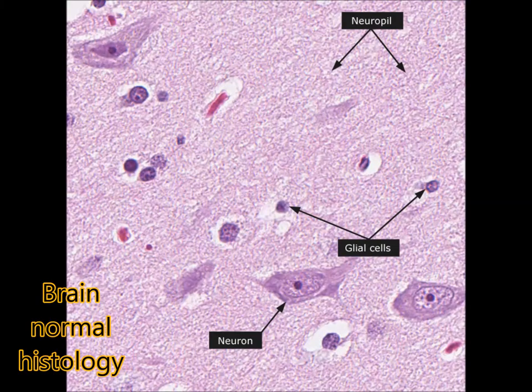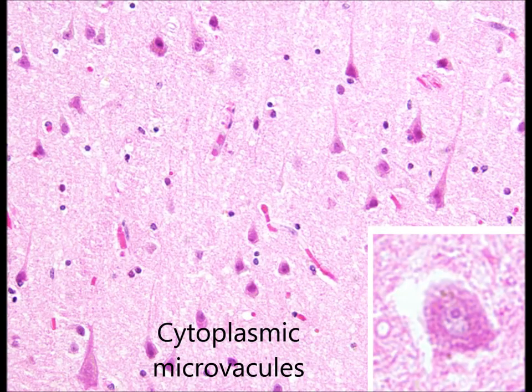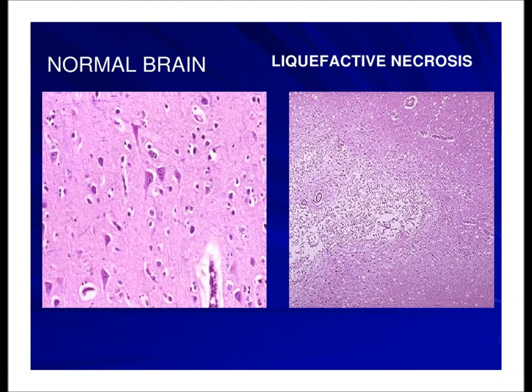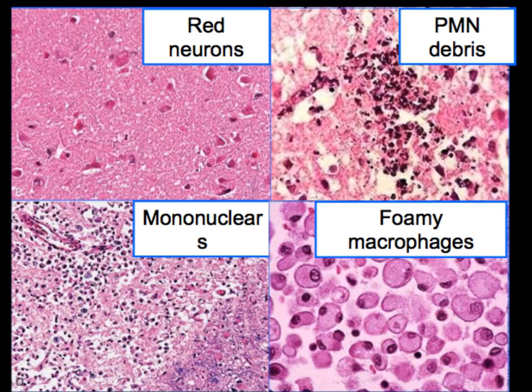Microscopically, this is the normal brain histology showing glial cells, neurons, and neuropil. The first morphological changes are the cytoplasmic micro vacuoles, and then the red neurons with marked eosinophilia and nuclear pycnosis. There is loss of architecture and disintegration of cells.